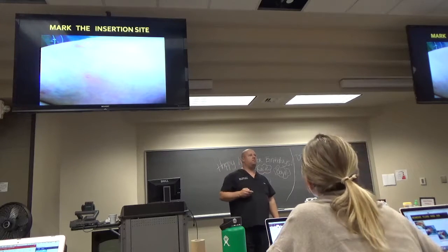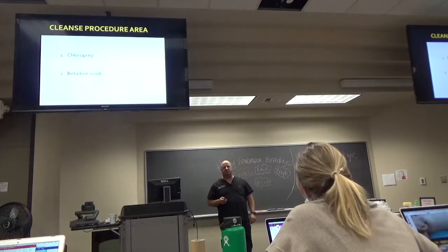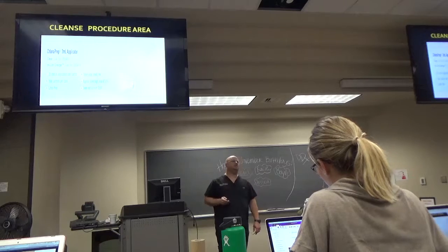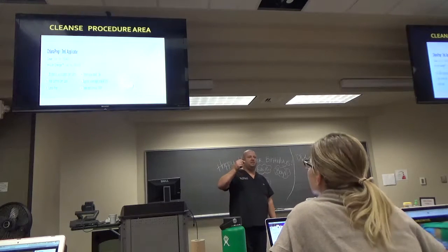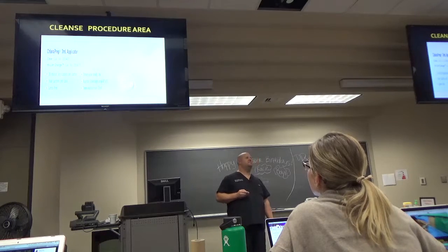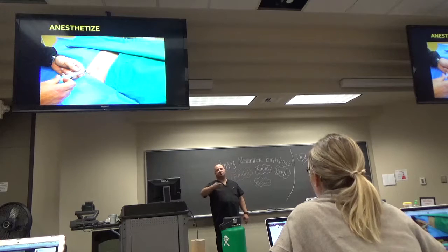So I'll take ChloraPrep and I'm cleaning it. You can use Betadine scrub, which takes a long time. You're supposed to let it sit on there for a few minutes, but ChloraPrep is really the standard that everybody uses, okay? Those little things you clip when you break and the liquid comes out on the end, you scrub. Okay? Anesthetize. Obviously, I would have on gloves if I were really doing this procedure.